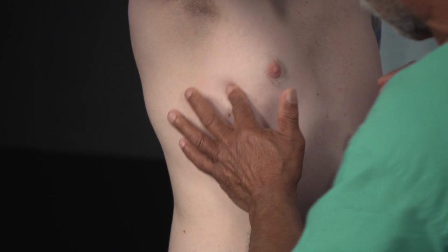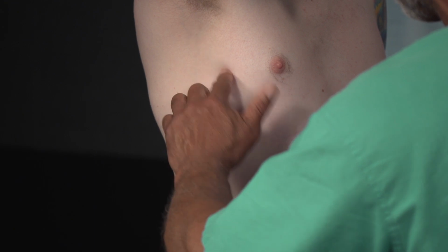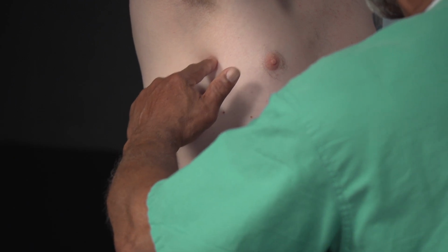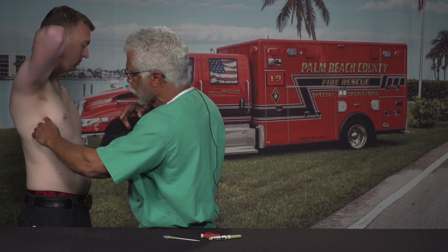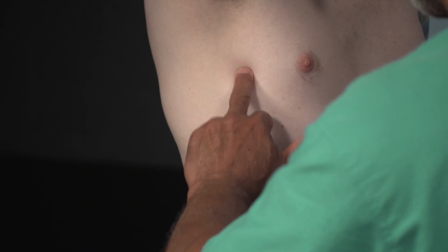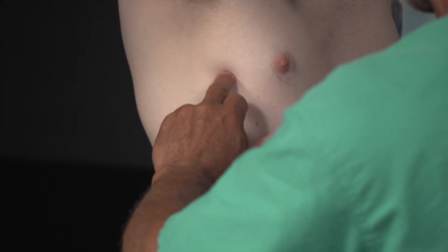So I like to stay anterior. I come to the nipple line, and you can see the ribs going like this, see? It's not a straight thing. The ribs are not like this. The ribs are coming like this. So it's very easy, when you come up here, to get deflected, and your needle might go up, or it might go down like this where you don't want it to go. You want to try to get the needle to come straight in like this. So you want to come at least at the fifth intercostal space right here, or right here, see? And then you feel the rib easily on him.